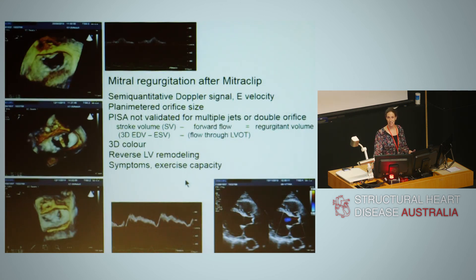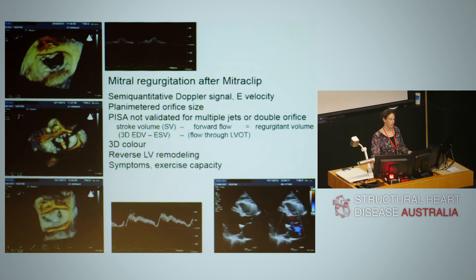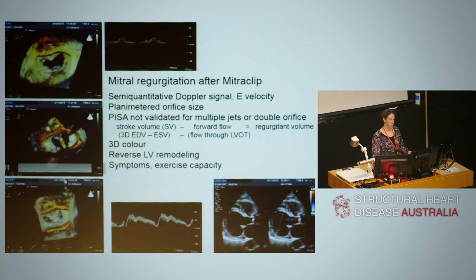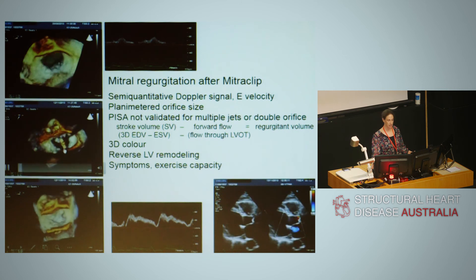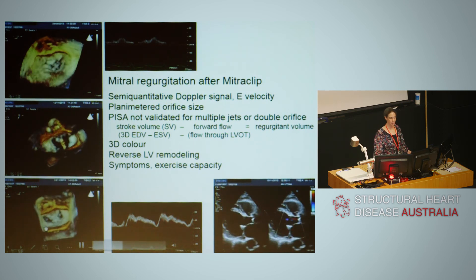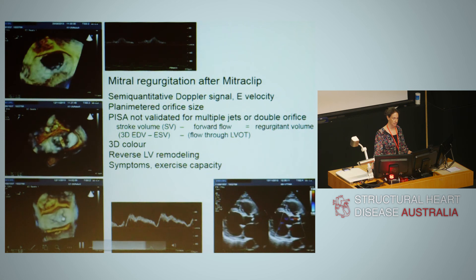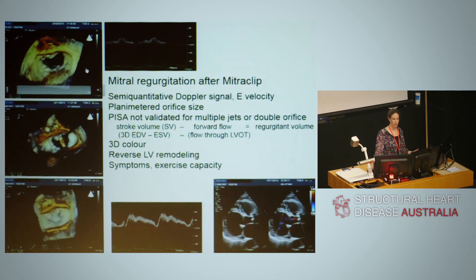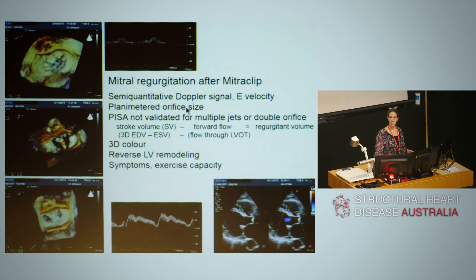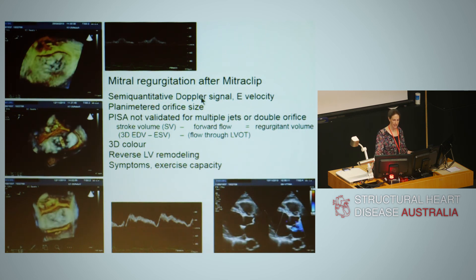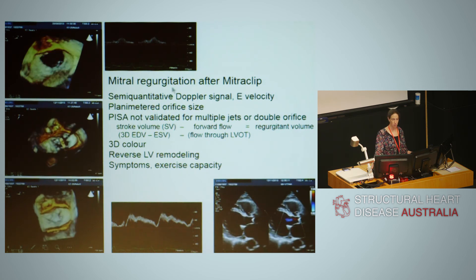How do we measure mitral regurgitation in unusual situations, for example after a MitraClip? The top panel shows a valve with reduced coaptation before the clip. The second shows the first clip being oriented to the anterior and posterior leaflet. The final image shows two clips in place, with a double orifice — an owl-eye appearance. We cannot use PISA because of the double orifice and multiple jets. We can use semi-quantitative assessment: jet size, E-velocity, direct orifice measurement, and pulmonary venous flow.